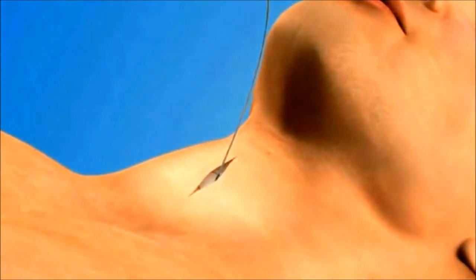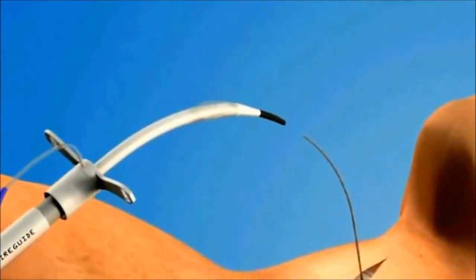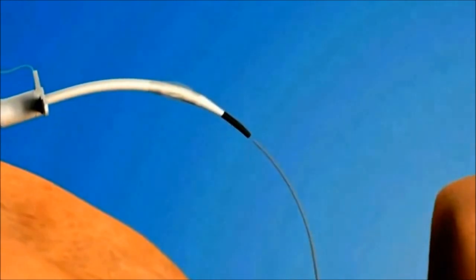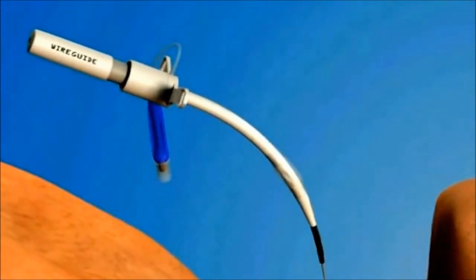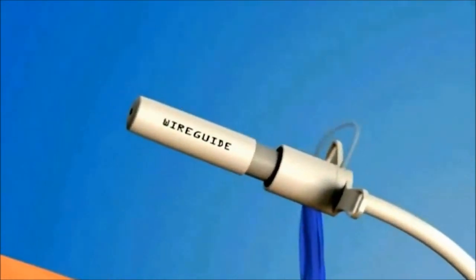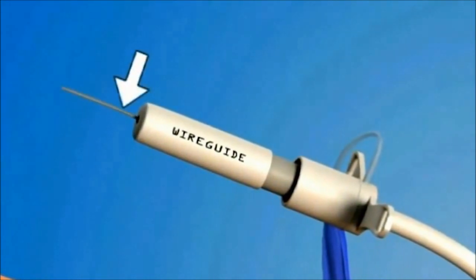Carefully guide the blunt dilator over the guide wire. Be sure that the wire fully passes through the dilator and that you control the proximal end of the wire before proceeding.